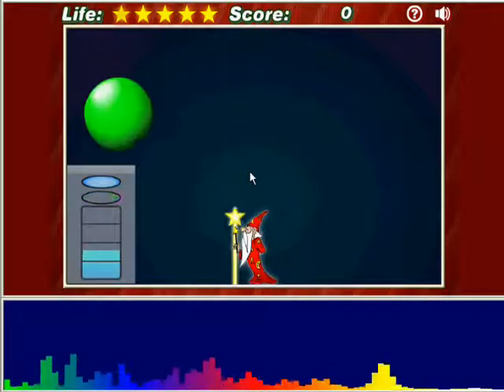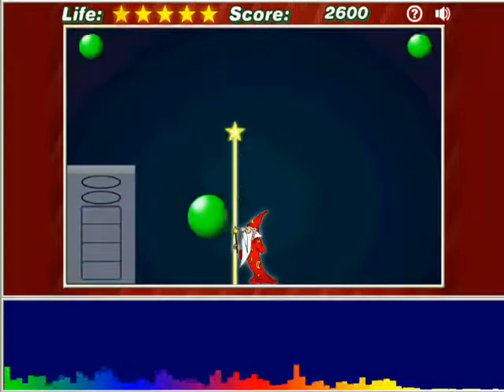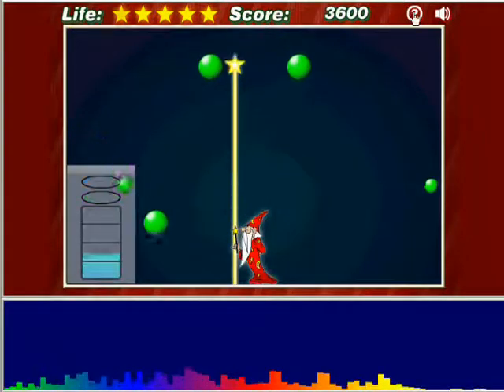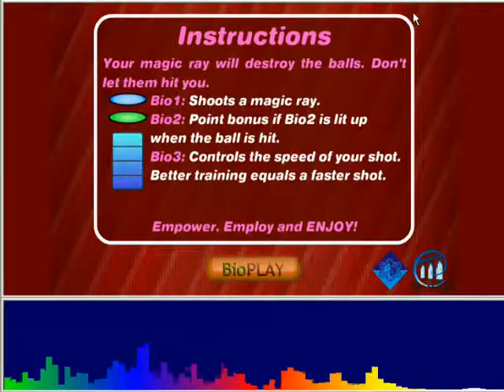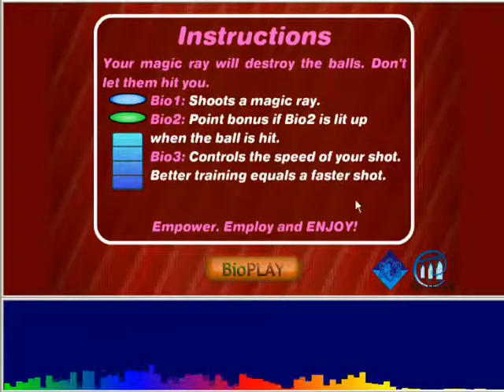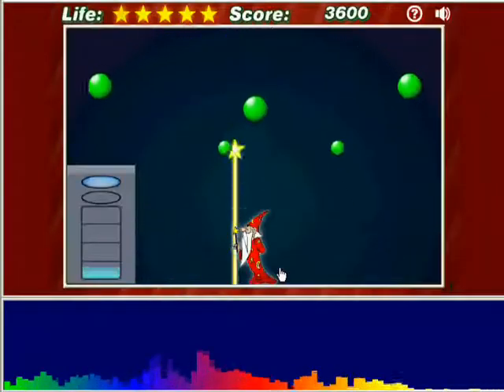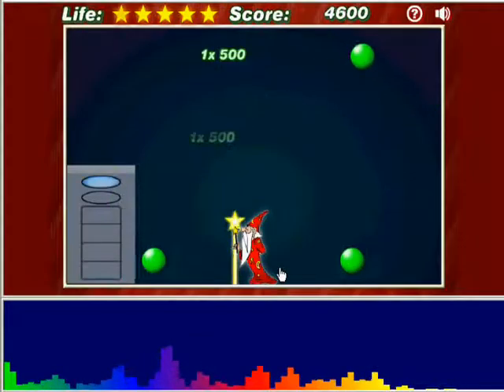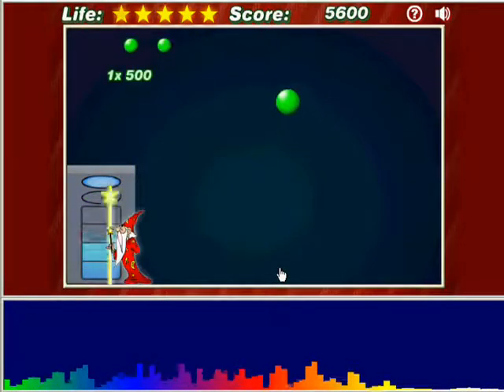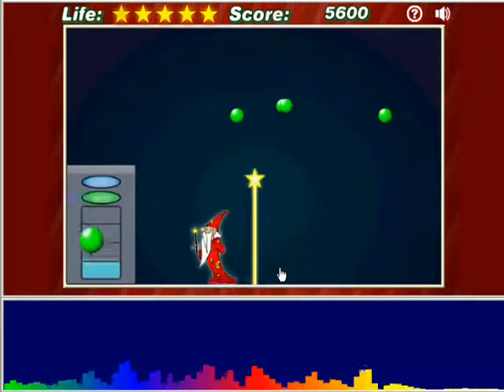To view instructions or to pause the game at any time, click the help icon at the top right. Direction control for games will be either keyboard, mouse, or hands-free. Games are otherwise controlled by physiology.